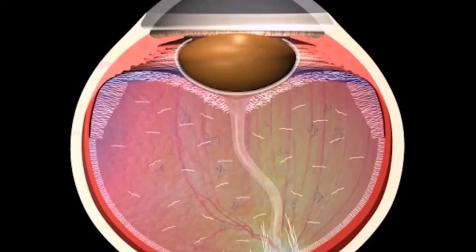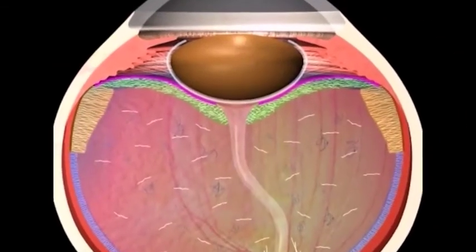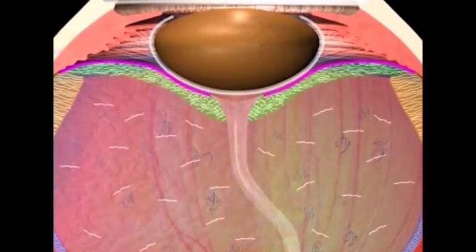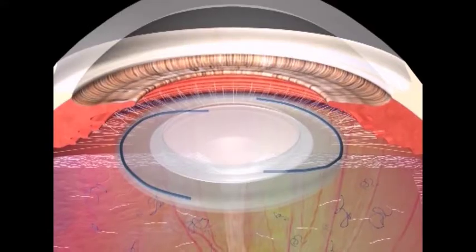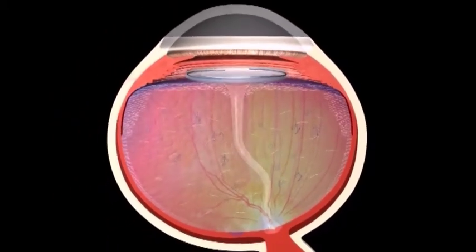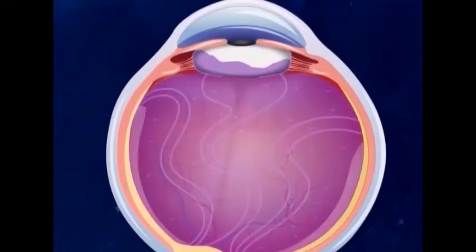What we never understood is that the posterior capsule and anterior vitreous act as one conjoined unit, and it is this entire unit together that provides a scaffold for IOL placement. The symmetry of this entire scaffold, in turn, ensures IOL stability. When the vitreous face is disrupted and only part of it is removed, the symmetry of the vitreous scaffold is disturbed. This animation explains it further.